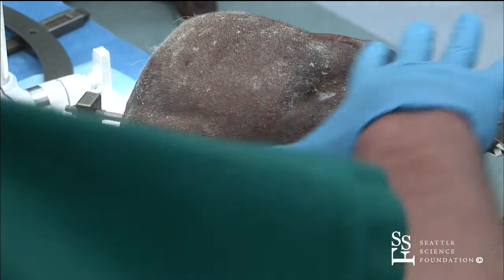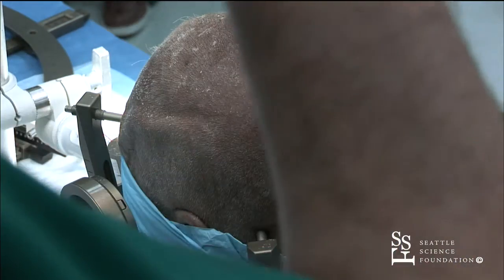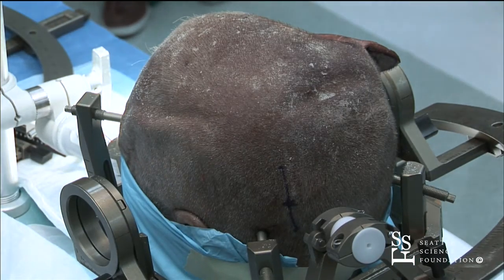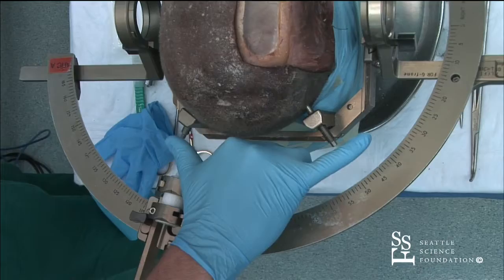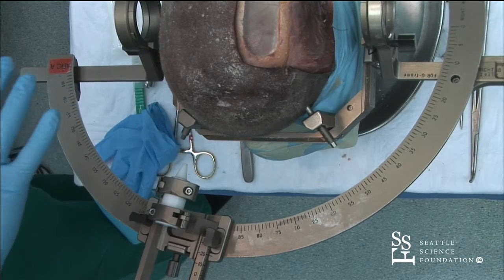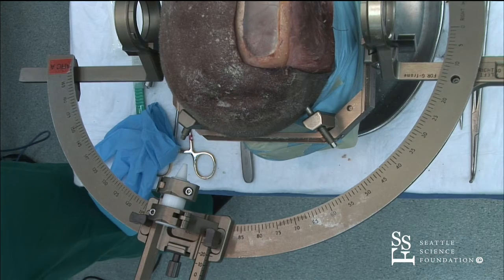You have to be careful that when you're defining in your software, whether it's the FrameLink software with Medtronic or this software with the Brainlab, that you have the correct frame selected and the correct orientation, because you can put this on either X is left or X is right, and that will end up giving you opposite coordinates if you don't select the right thing.